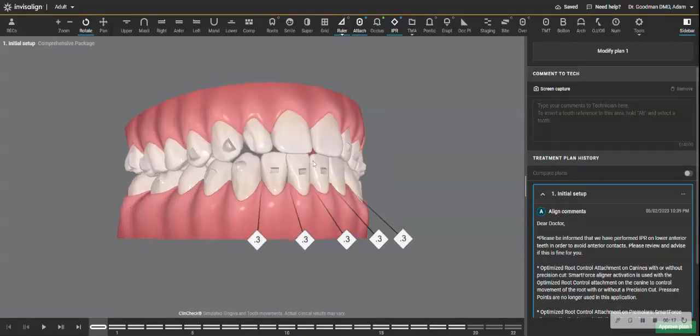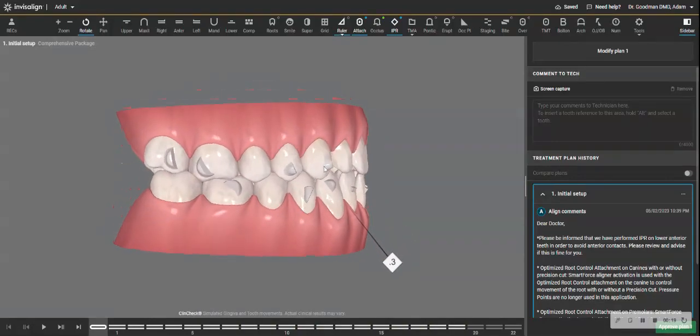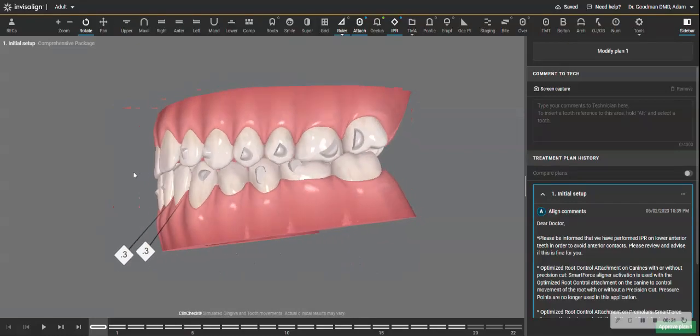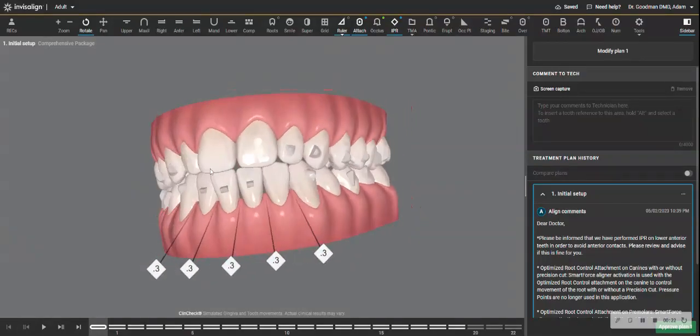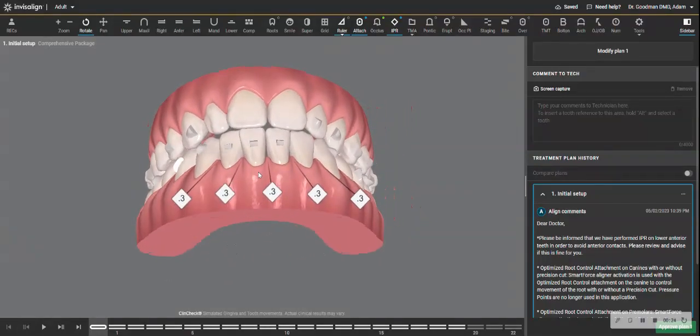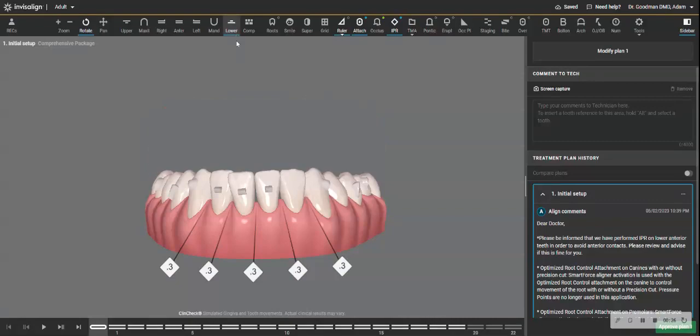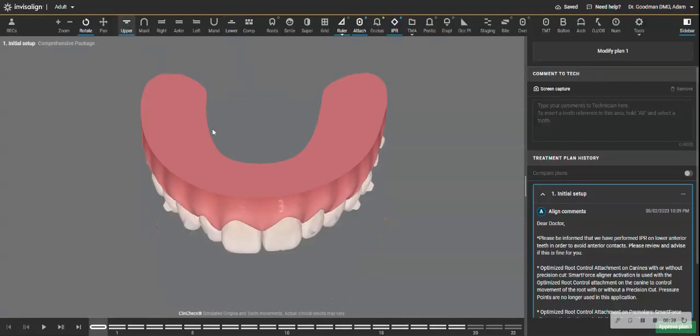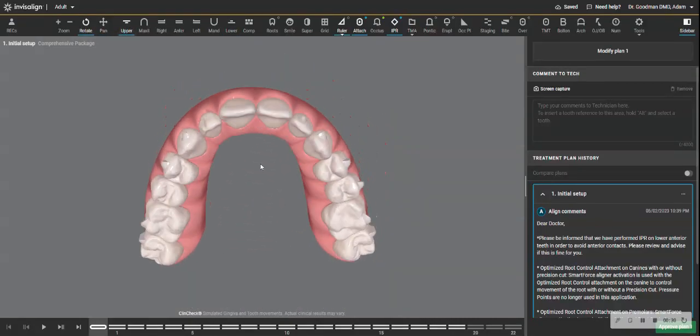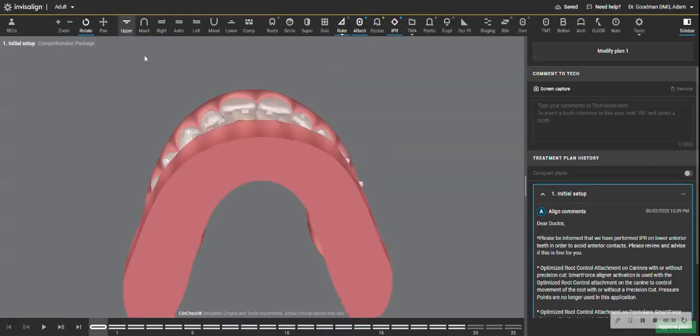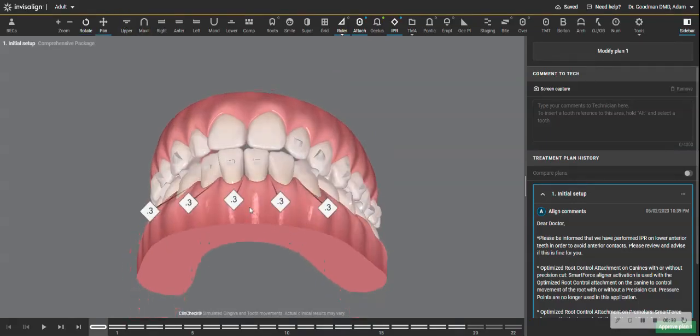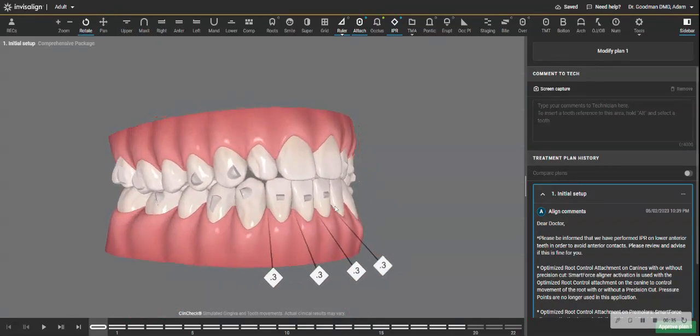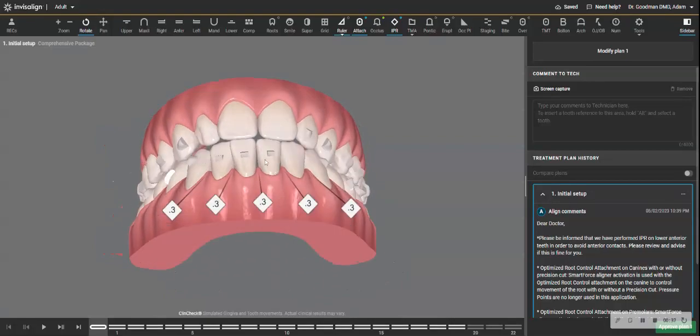So what do we have here? We have a Class 1 bilaterally, edge-to-edge anterior. We have a little lower crowding, not much upper crowding. So this is a good example of a case with a Bolton discrepancy because it's a Class 1, but it's edge-to-edge anterior. And the culprit really are the laterals, especially this lateral being small.